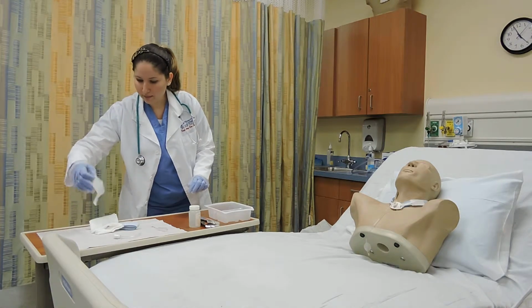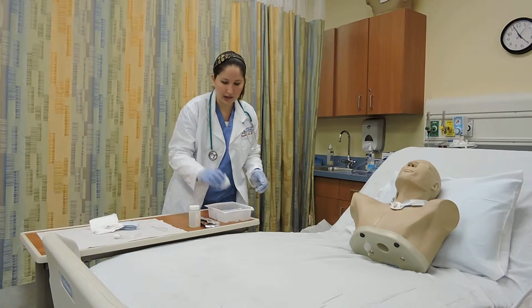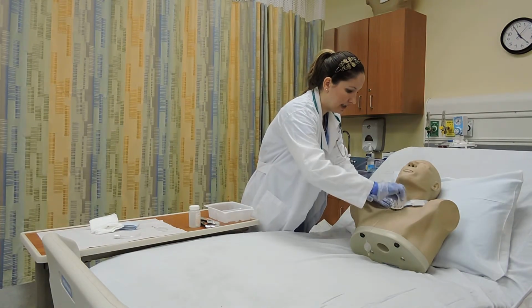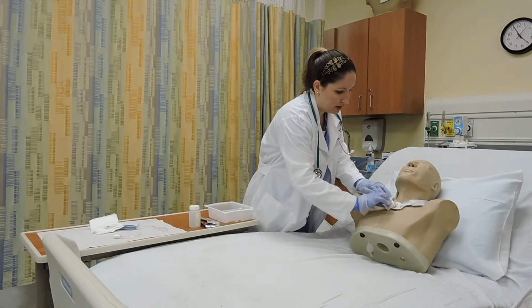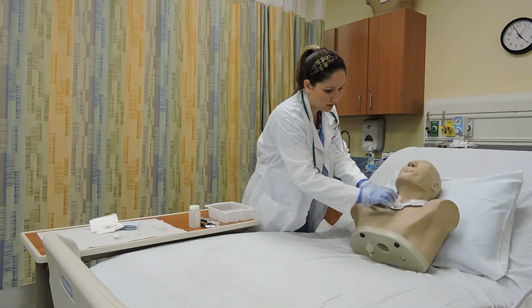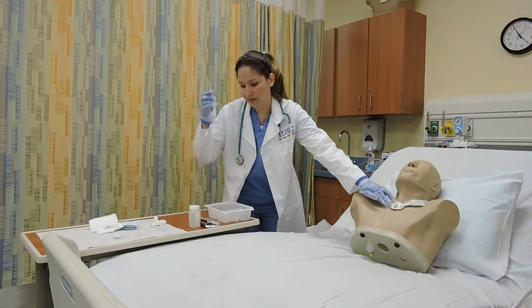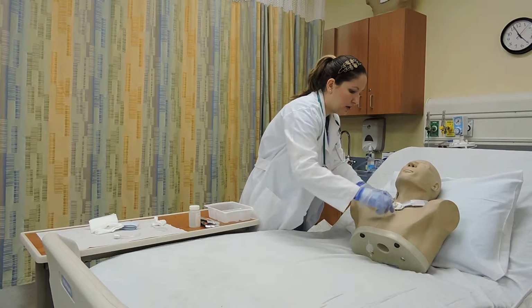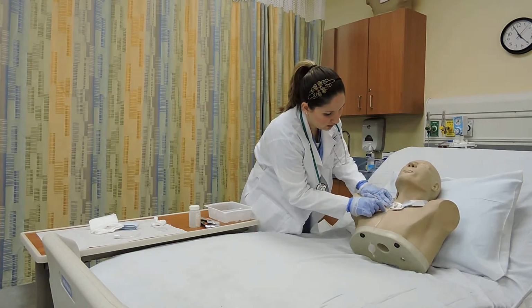We're going to grab a 4x4 gauze and dip it into the hydrogen peroxide and sterile water mixture. We're going to gently clean the surroundings of the stoma area and the outside of the tracheostomy tube. For the hard to reach areas, we're going to grab a Q-tip, dip it into the mixture, and clean the hard to get mucus or gunk.